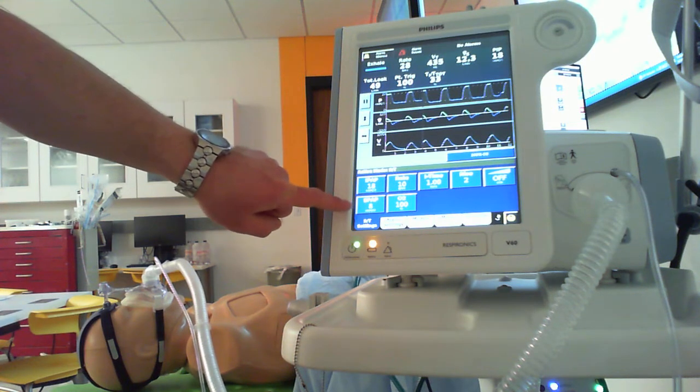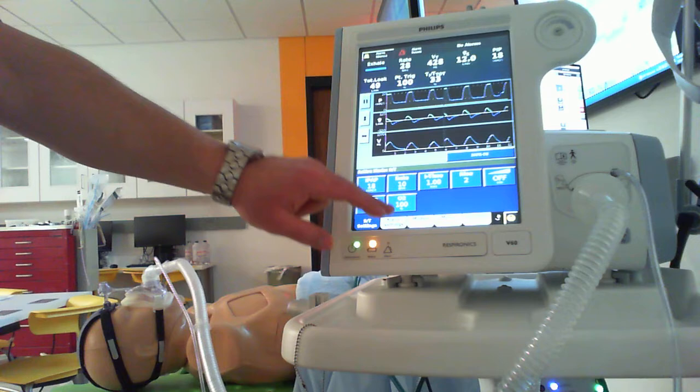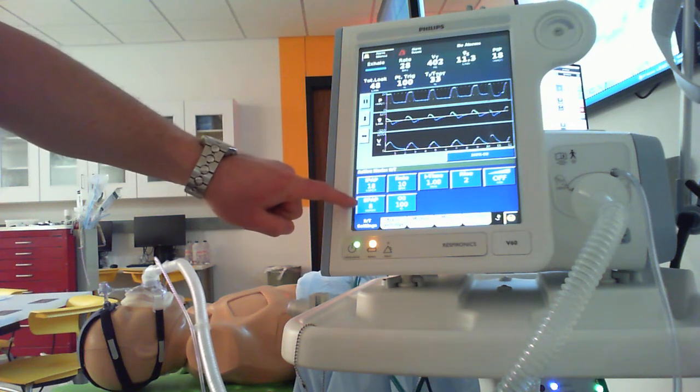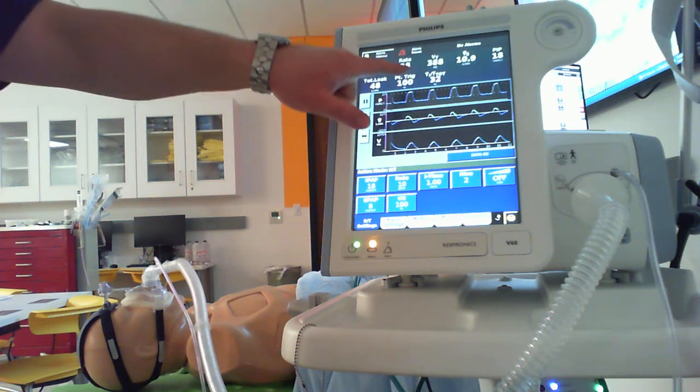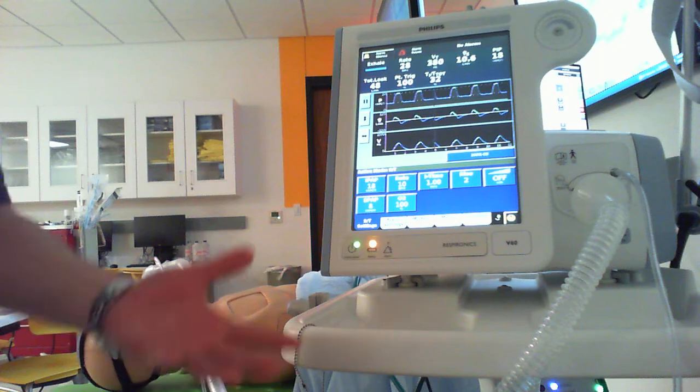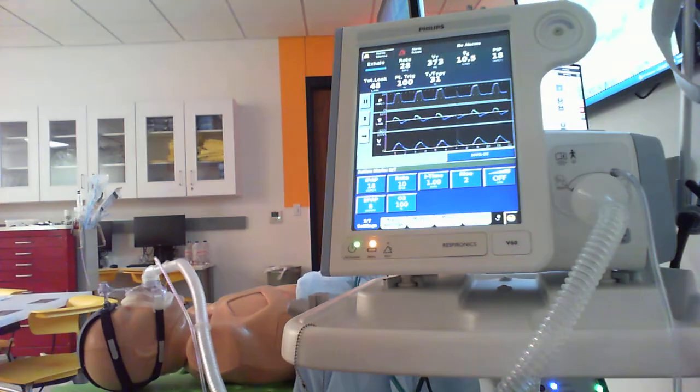I made a change to improve oxygenation, and hopefully that will improve and allow me to wean my FiO2 down and/or reach my goal. All right, but what's going to take place? My pressure support dropped. You're going to see your tidal volume drop off. As that tidal volume drops off, it's less effective at alveolar ventilation. You're going to see that work of breathing and respiratory rate typically increase again.